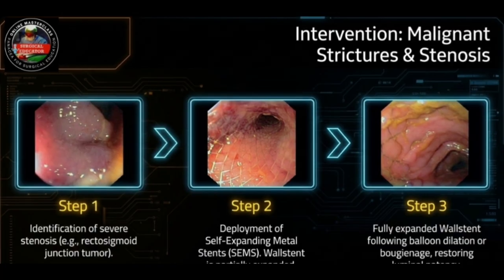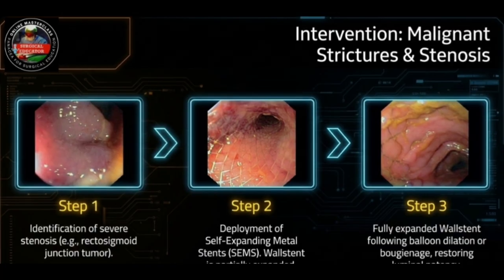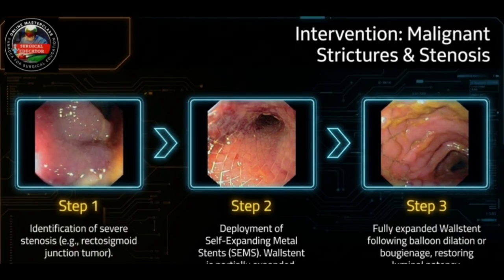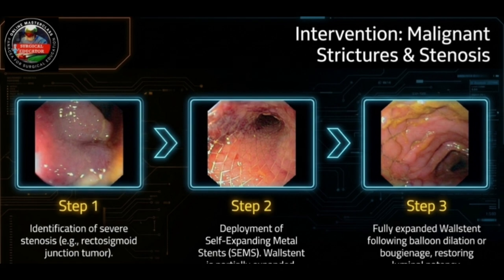That's incredible. It really is. This allows the bowel to decompress, which often saves the patient from needing an emergency, high-risk open surgery, converting it into a much safer elective procedure later on. You are fundamentally restructuring the anatomy from the inside out. But anytime we are cutting tissue or prying tumors, bleeding is a major risk, right?